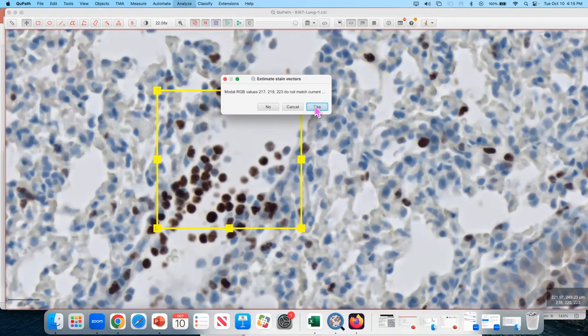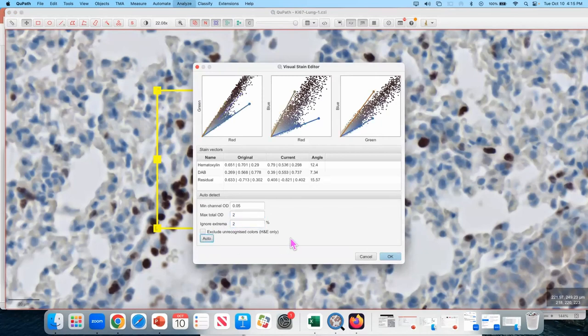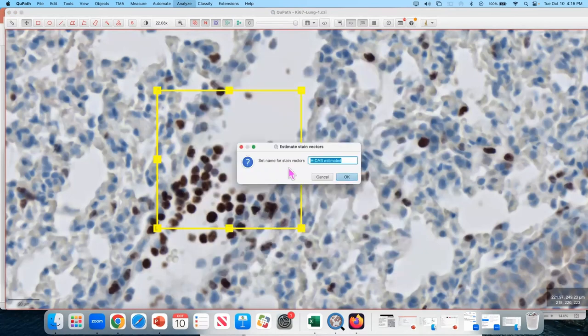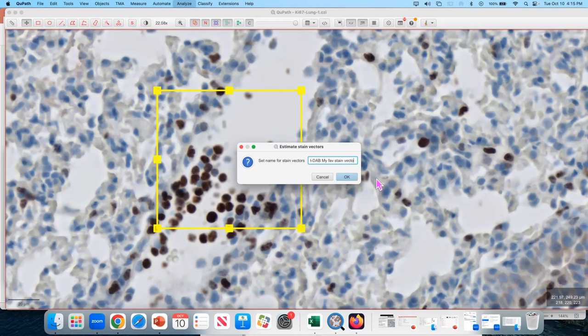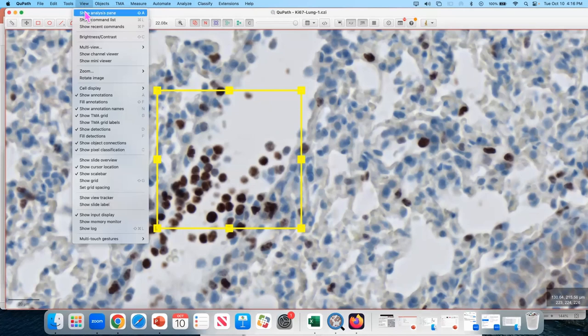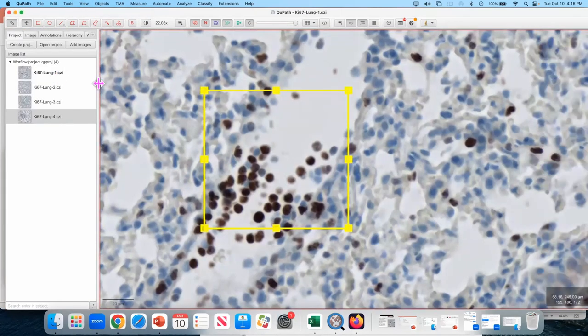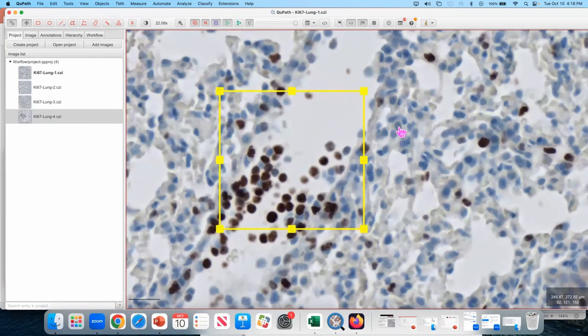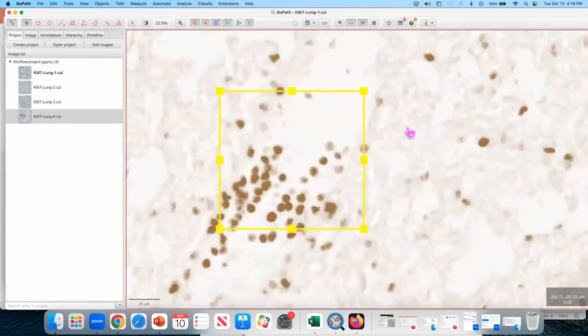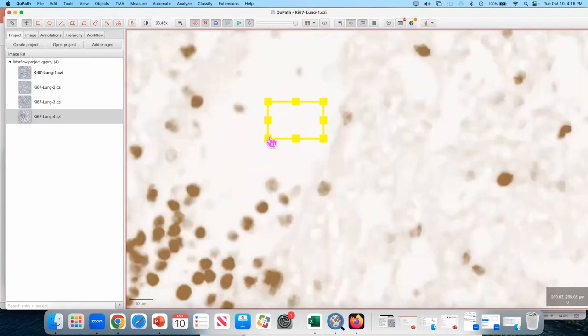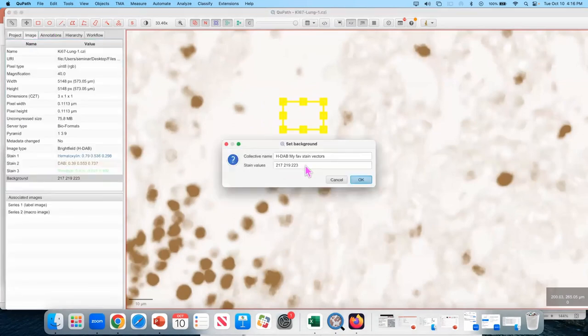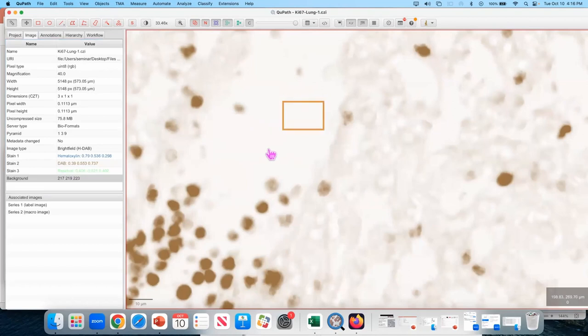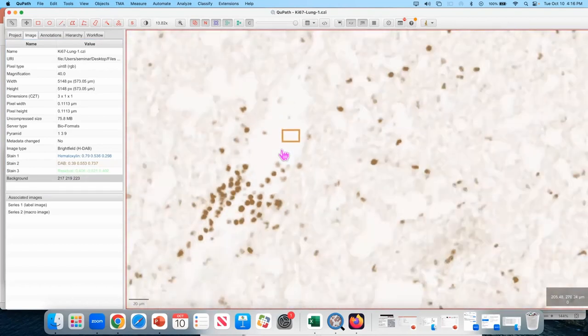So I will try to find an area that has some background pixels, some examples of hematoxylin, some examples of eosin and DAB, and estimate stain vectors. I'm going to match the current model values. And I'm going to call it something specific, you can leave it estimate, but I'm going to call it my path stain vector, bring our analysis pane. So if I now inspect that, I may have improved a little bit, but I'd like to get this a little cleaner.